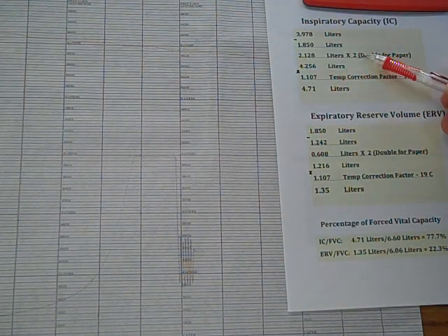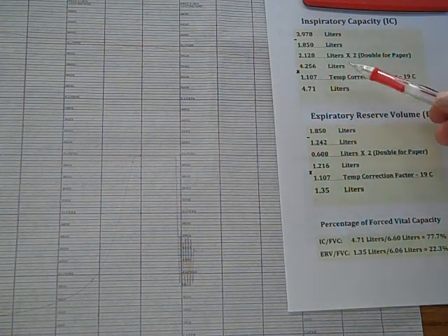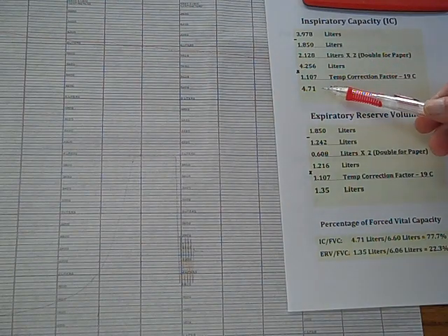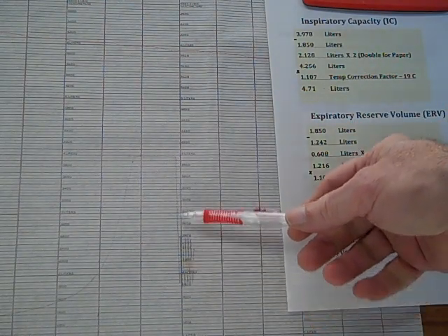We would need to double for the paper, giving us about 4.2 liters, and then we have to make the correction for the temperature, which was 19 degrees Celsius, and this is the correction factor to convert that volume to BTPS, or body temperature, giving us a value of about 4.7 liters from here to there.